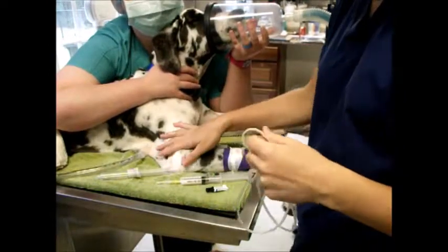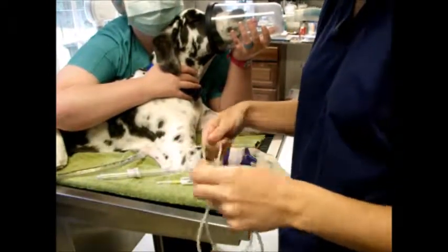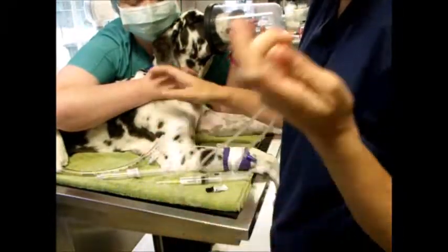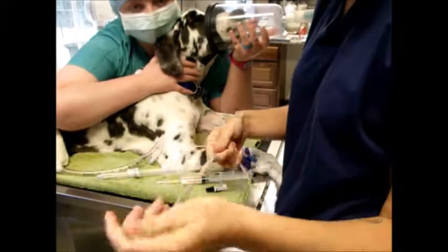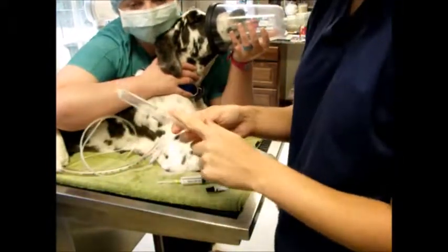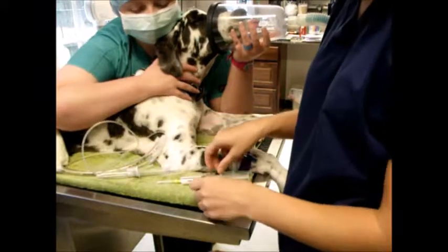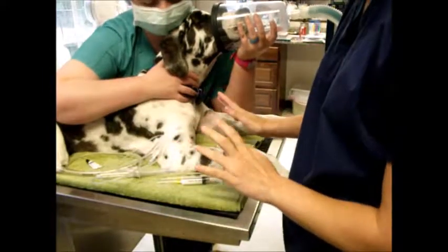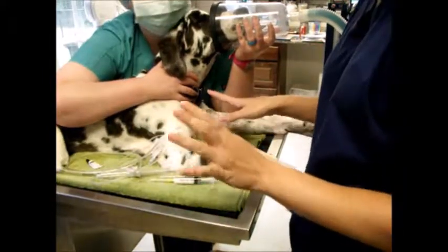So before I start, I want to double-check that I've got all my supplies. I've got my size 10 ET tube. I've got a 9.5 if needed, but we already checked her — she should be about a 10. I've got some line to tie her in, my 12 ml syringe for inflating the cuff, flush of course, and then I've got some eye lube for her as well. We'll double-check and get everything ready.